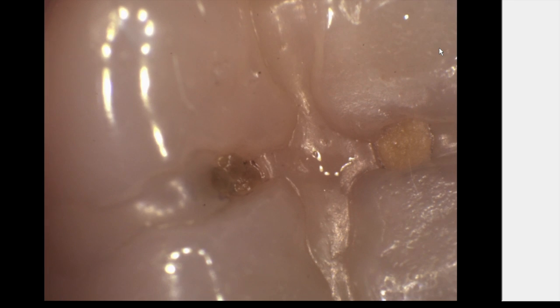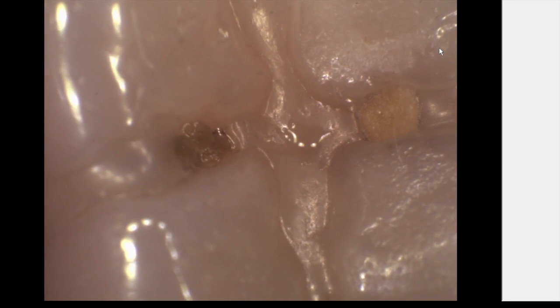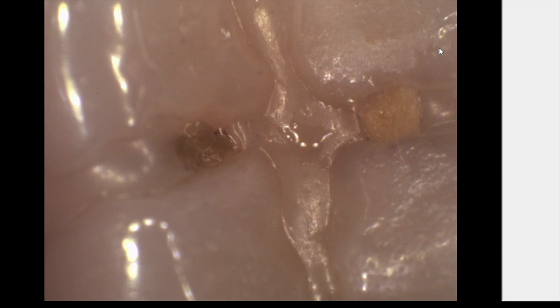Here's an example of the loom detecting caries. We see two spots in this tooth and with careful observation we can see that there's something going on underneath, but it's not terribly clear. By placing the loom over this tooth, now we see those two initial indications of caries and then we can see what's happening underneath in x-ray like images. We can see the spread of the caries underneath those two spots.